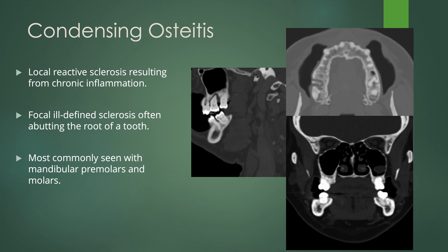Last but not least, we have condensing osteitis. This is local reactive sclerosis resulting from chronic inflammation. It can be ill-defined, abutting the root of a tooth that usually has some sort of periodontal disease associated with it. You see periapical lucency and then sclerosis in the adjacent bone, purely from chronic irritation and inflammation from chronic periodontal disease. This is most commonly seen with mandibular premolars and molars.